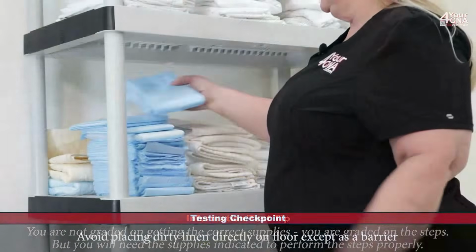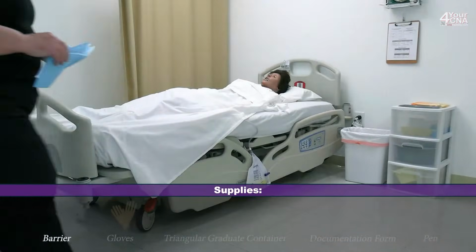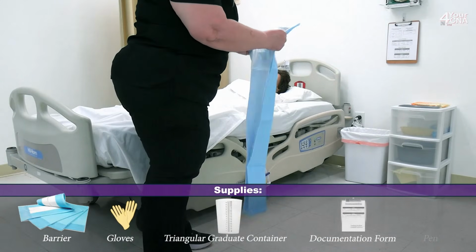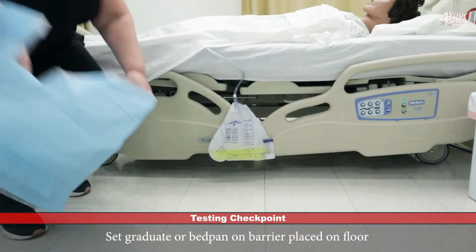We're going to start with the chucks. This is going to go on the floor under the bag. We're going to place the barrier on the floor directly under the urinary drainage bag. So we'll unfold it and we'll place it under the bag with the absorbent side facing up.